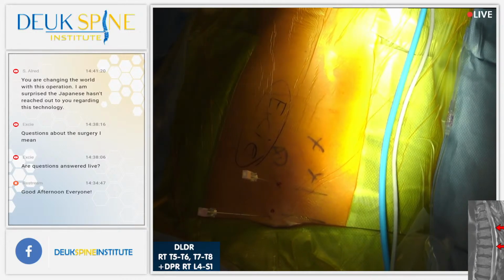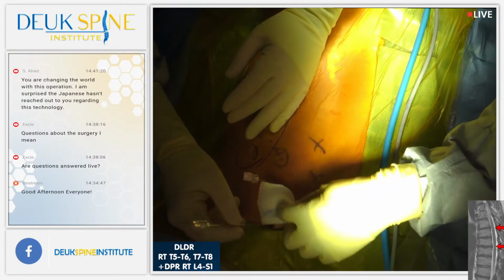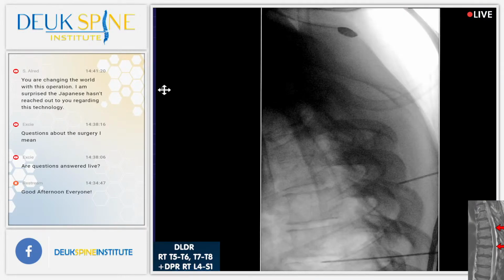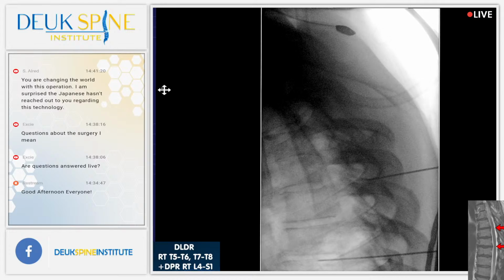All right. So, we're literally at the top of our incision, and this is where the other disc is that we agreed to treat. Shot? You're doing great, by the way. Hang in there, okay? Yeah, we're almost done with the hard part, with you being awake. Shot? I could feel the facet, and I want to go just lateral to the facet. Yeah, I know. I apologize. That's uncomfortable.